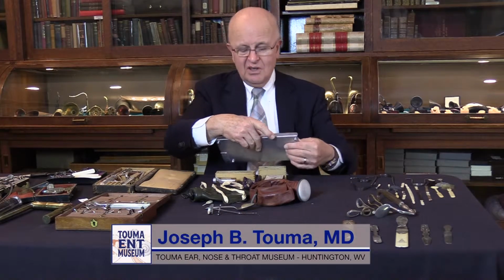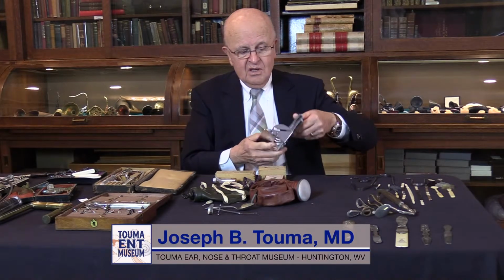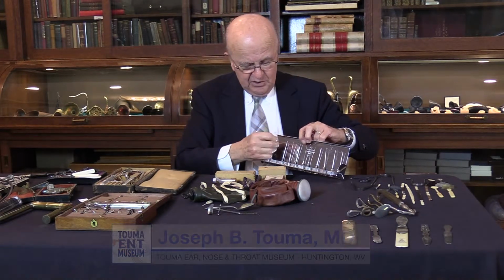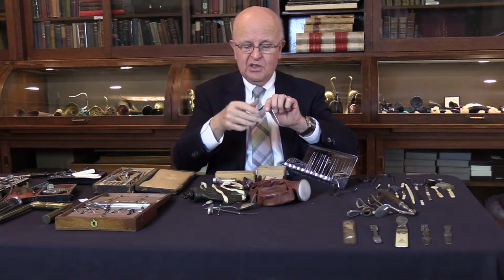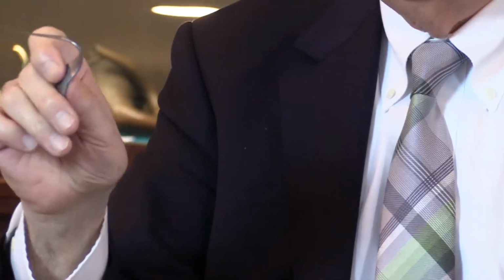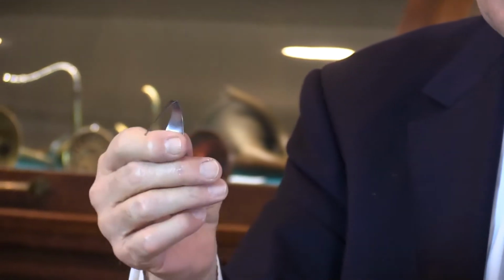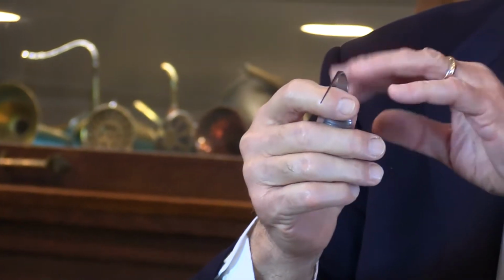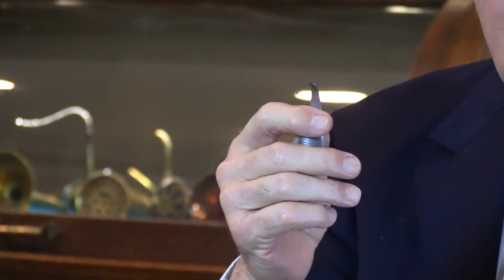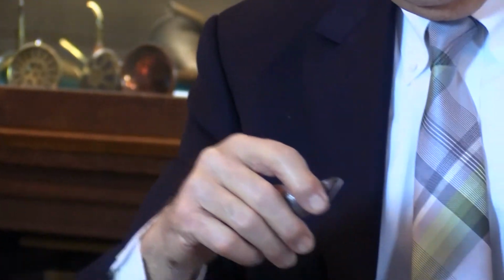One more thing I want to share with you. When microsurgery of the ear became a reality, the earlier picks that they used looked like this. So they have this type of instrument. You hold it like this, instead of the straight picks that we use now. And the same thing, they had micro scissors, cup forceps. They are all like this, and I mean, you can give them credit, because this way your hand, everything will be out of the way. But it didn't catch on, and that was used for maybe 4 or 5 years, and then the straight picks and scissors and whatever came to the market.